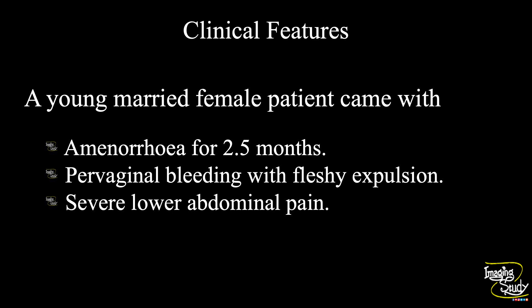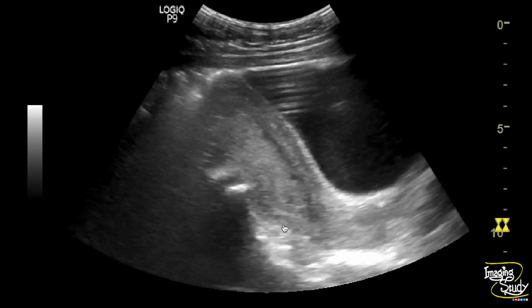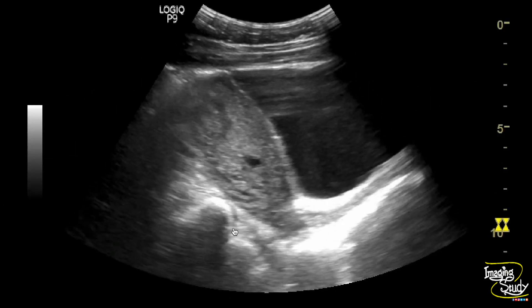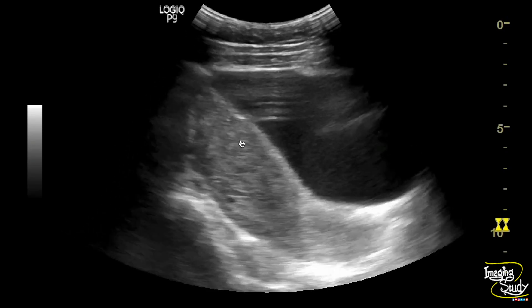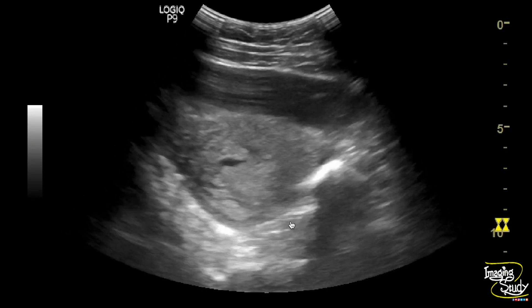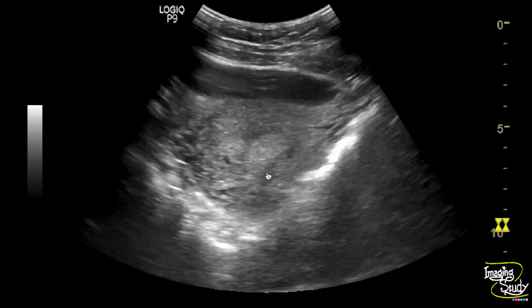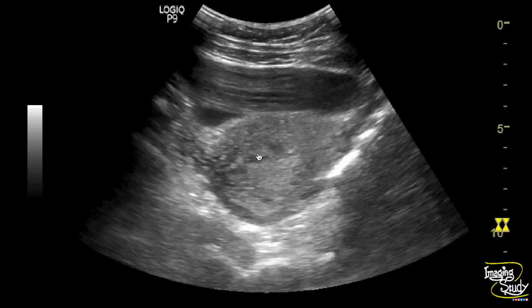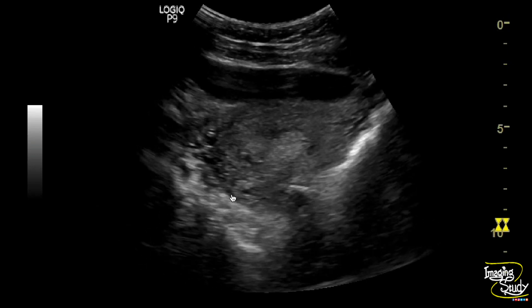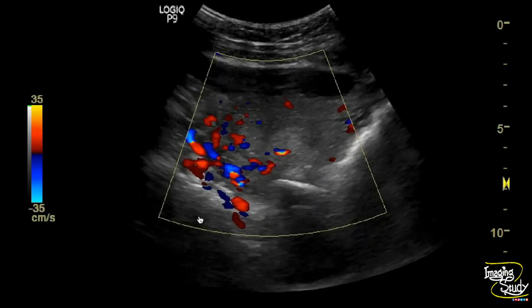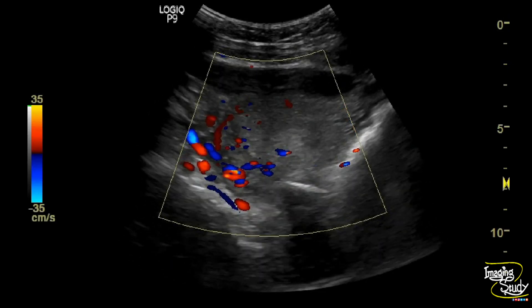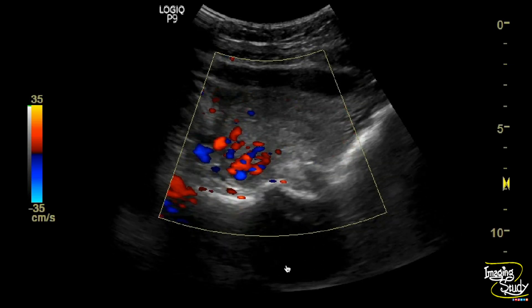Let's see what we have got on ultrasound. Here you can see the longitudinal section of the uterus. You can see some irregular mixed echogenic substance within the uterine cavity, which can be well visualized on the transverse section. You can also see some cystic areas here, which on color Doppler appear as blood vessels showing flow within.